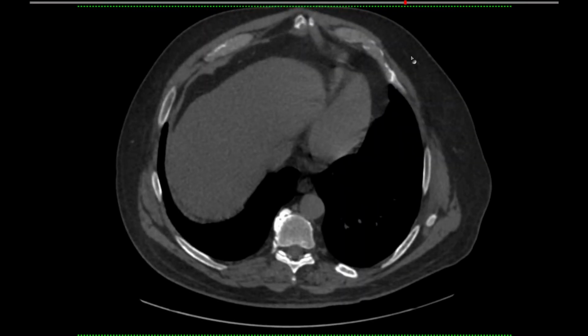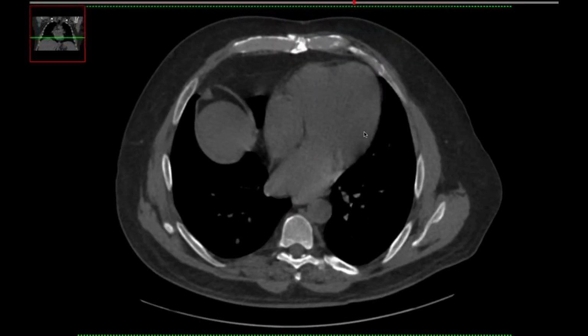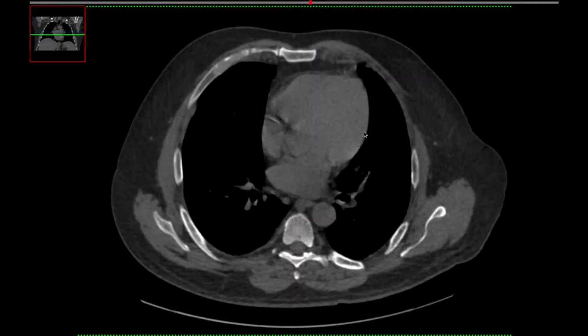Jeff, how about Mr. Spleen? How's Mr. Spleen doing? Not in this case, but that doesn't exclude it. I would say, David, I see the speckled spleen most of the time, a couple times a week. Okay. But yeah, you're absolutely right. It's pretty much a slam dunk histo.